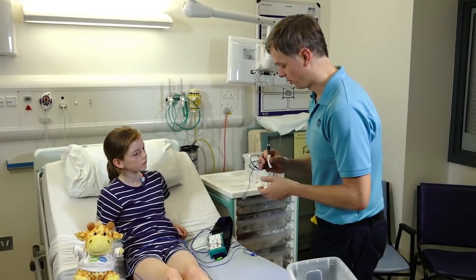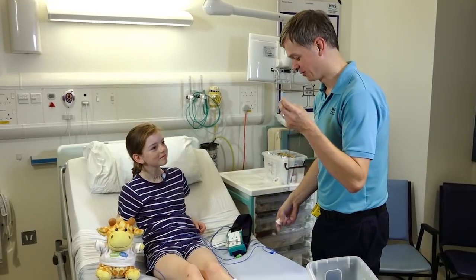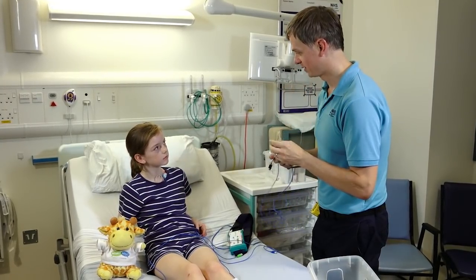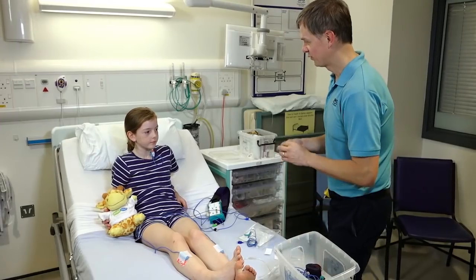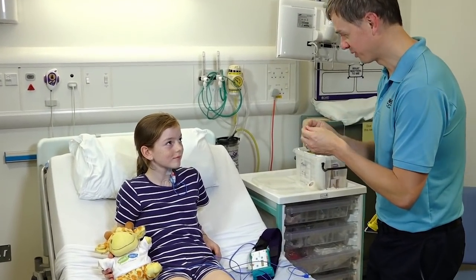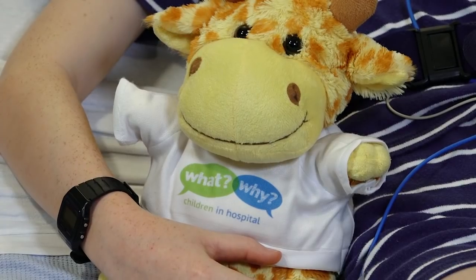The next one I'm going to put on is just to help us see if you snore. It's like a little microphone and what we do is put it on the side of the neck where it picks up the vibrations. We'll use a little bit of sticky tape to make sure it stays on, so I'm afraid you're going to get a little bit of a moustache for tonight. We've got a great magic rock that we'll use in the morning to get them off, so don't be pulling them off.